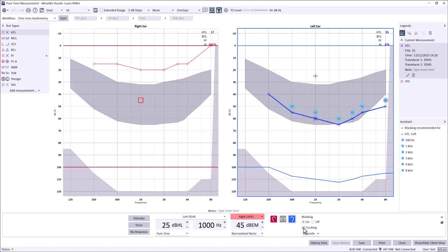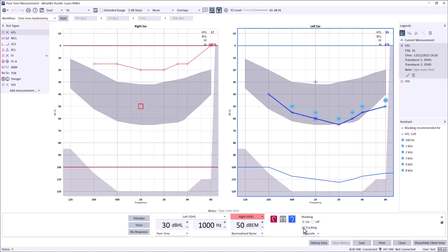To manually adjust your masking level, use the plus and minus indicators to the right of where the masking intensity level is displayed. To adjust pure tone presentation level, you can utilize the up and down arrow keys on your keyboard.